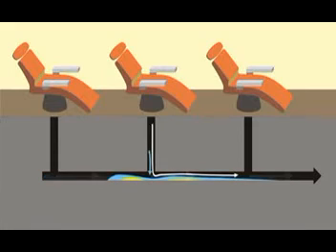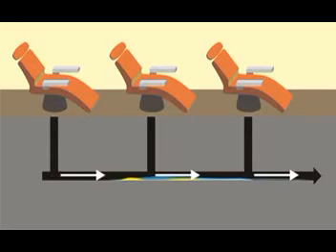When the HVE is closed, the air flow stops and the liquid slows down and can lay in the trunk line, leaving debris to settle in the pipe, causing buildup. An example of this would be if you sucked up a gallon of liquid at the dental chair, you would not get a gallon of liquid into the collection tank. It would lay in the trunk line, and some of the liquid would evaporate into the air as the air flows by going to the collection tank.